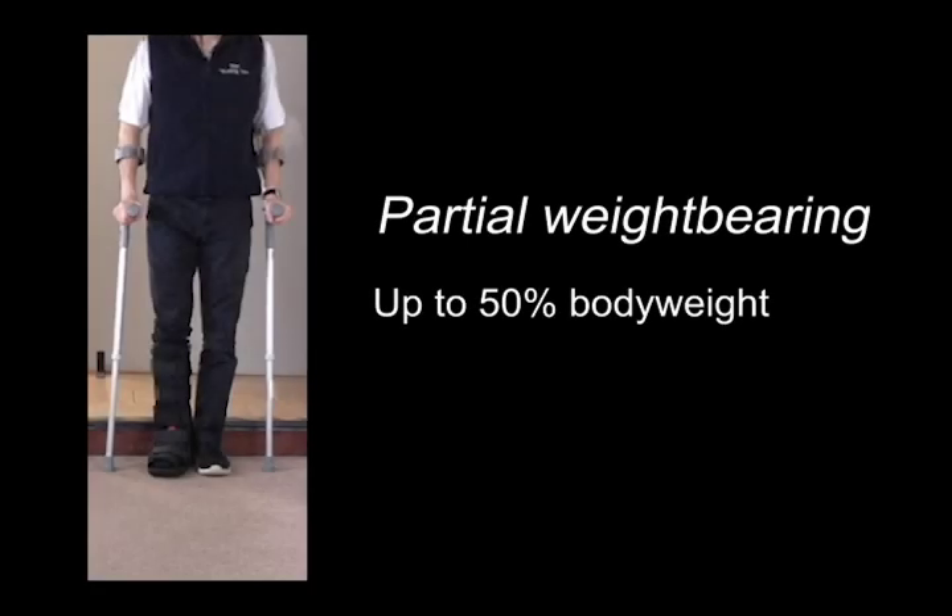If your affected leg is partial weight-bearing, you may place a light load through your leg, usually up to half your body weight. You may check this with your health professional.